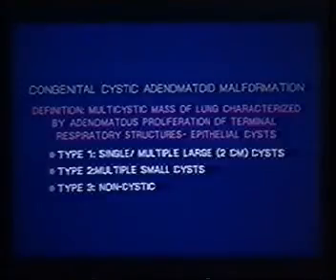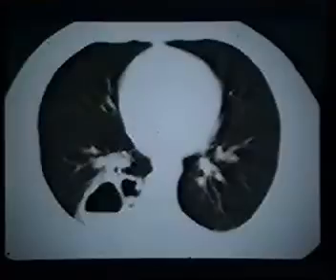One sees, for example, here a mass in the right lower lobe. There's an air fluid level. One might wonder about some kind of infected cyst or perhaps even a sequestration, which is what our first thought was. But in fact, what we see are these multiseptated, thick-walled cystic masses. This is another patient who presented with the same. Both of these patients were over the age of 30, and at surgery, both of these represented a cystic adenomatoid malformation. At least you can say that you've seen two of them.